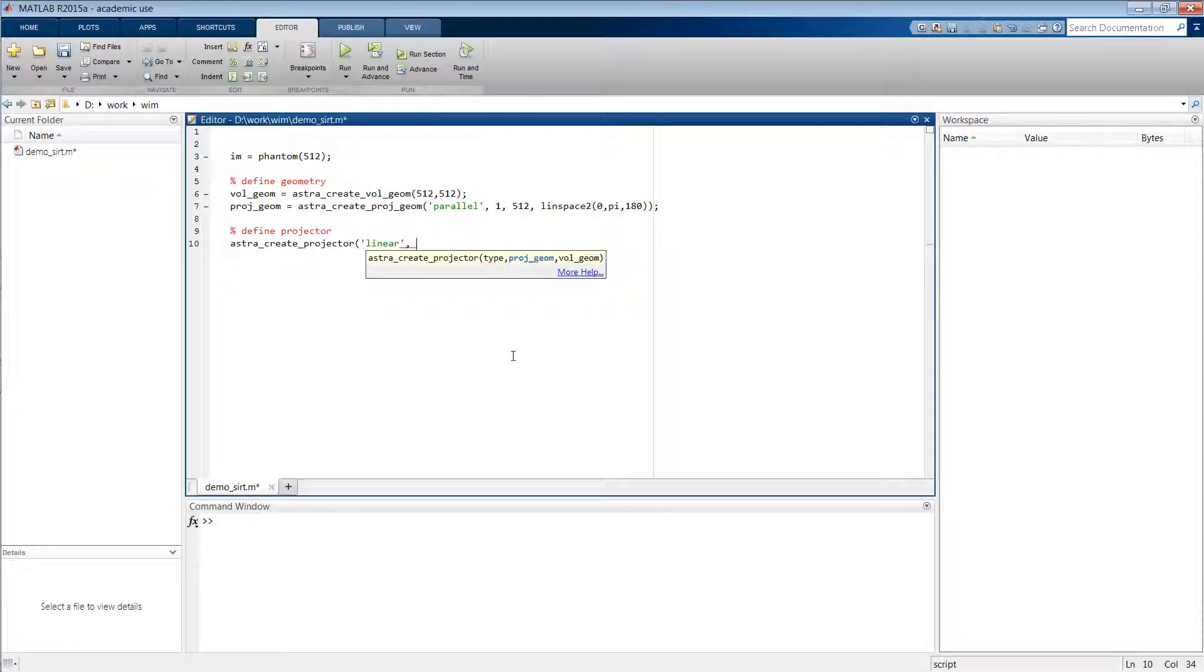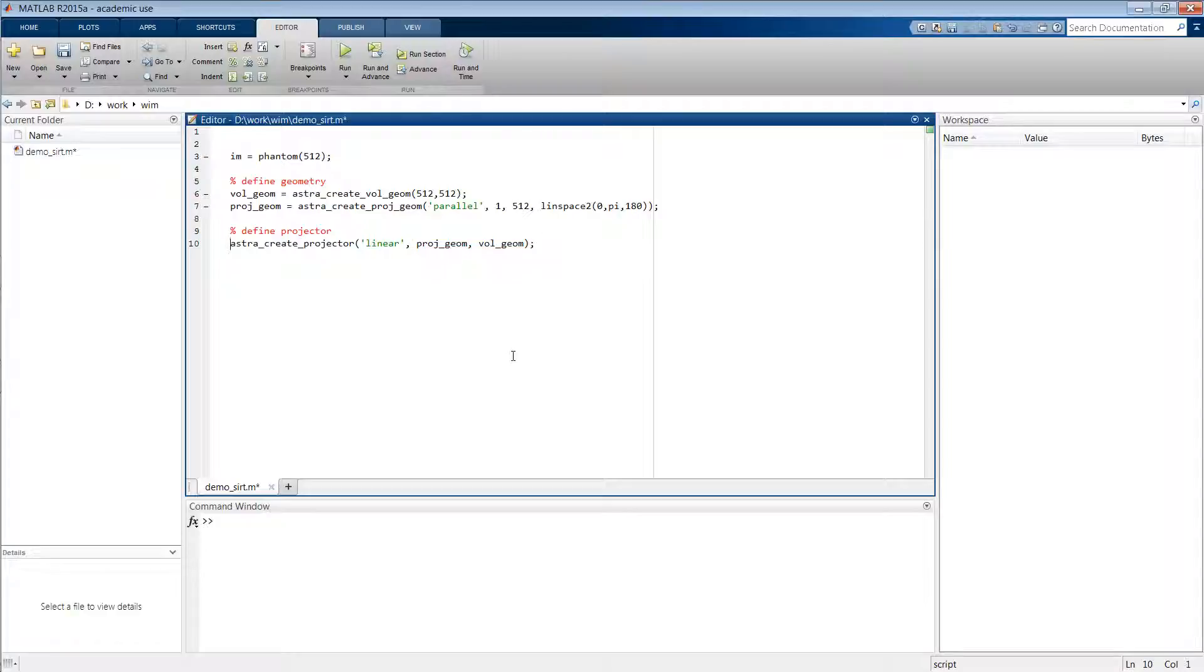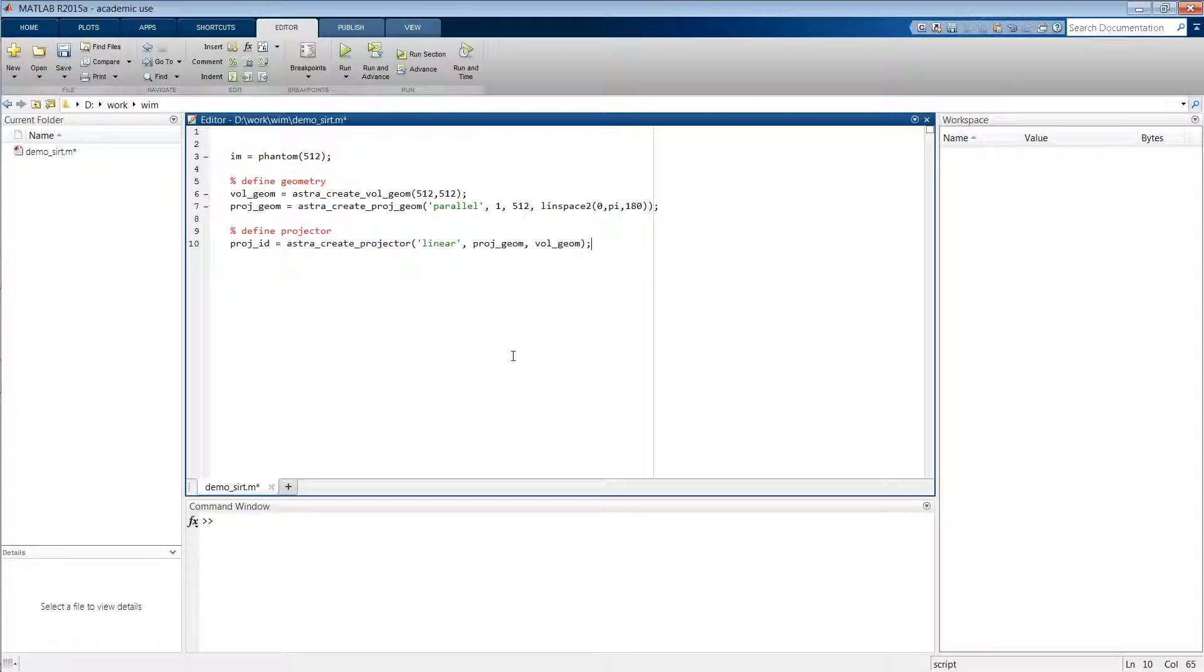And then we also link the projection geometry to the volume geometry in this projector object. This function then returns an identifier to the projector which we can subsequently use.